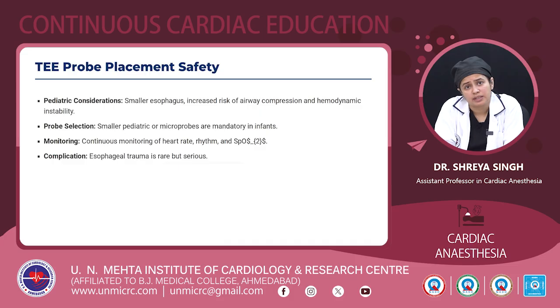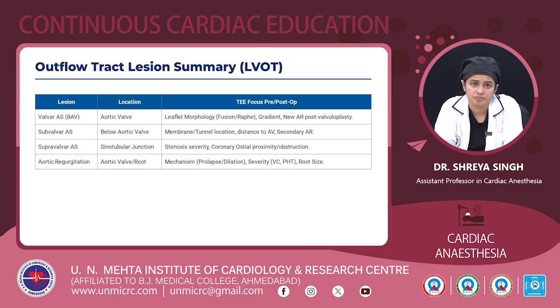Talking about the TEE probe and its placement safety. We're talking about the pediatric population here. They have a smaller esophagus, and there's increased risk of airway compression and hemodynamic instability. So we need to use smaller pediatric or micro probes in infants. We need to continuously monitor the heart rate, rhythm, and SpO2, and look for esophageal trauma, which is rare but can be serious.